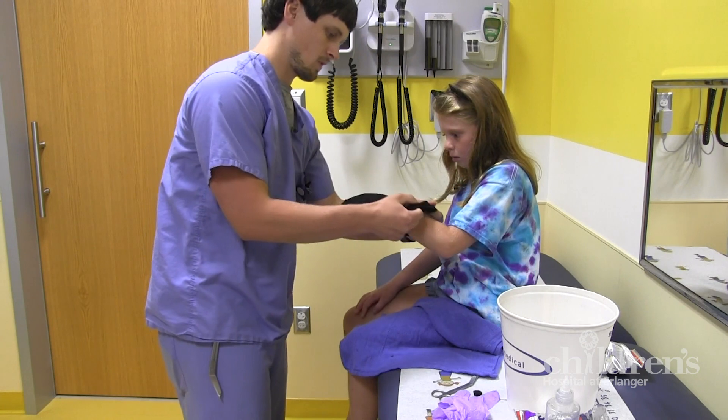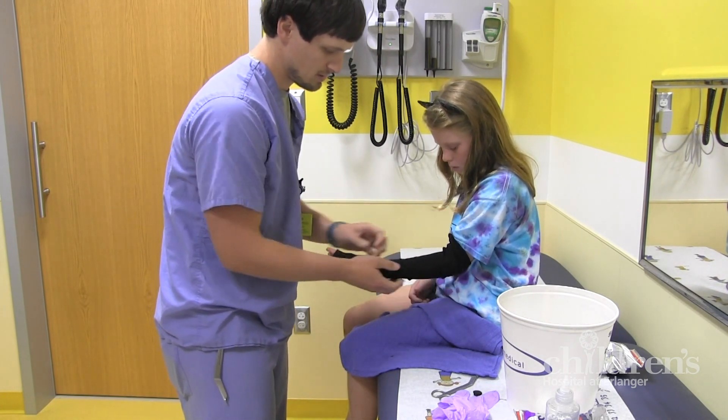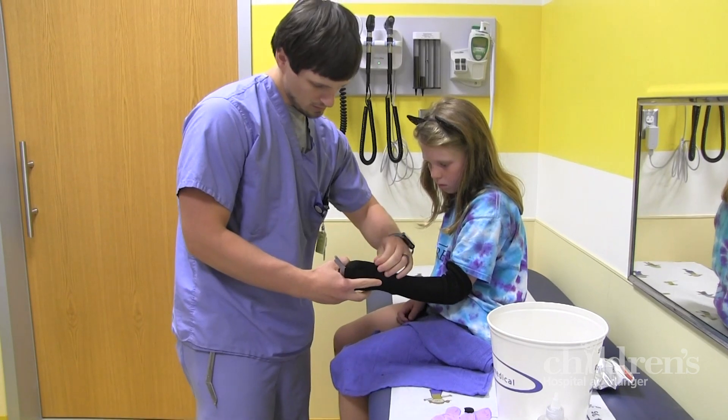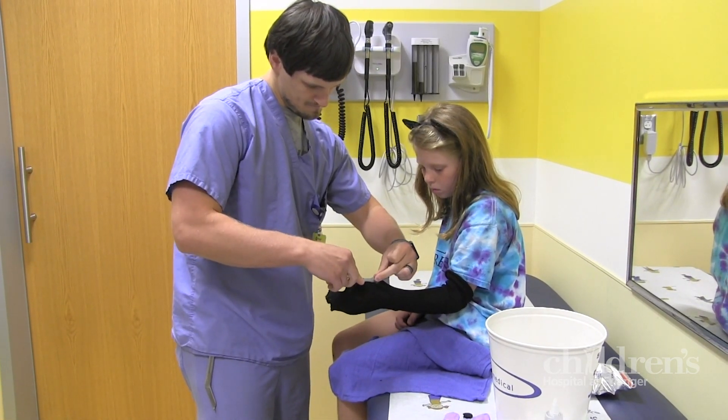The casting technician will start by making a sleeve for your injured limb. We use a sock-like material that creates a comfortable layer between your skin and the cast. The technician will use special scissors to trim the materials — don't worry though, these scissors aren't for cutting skin.